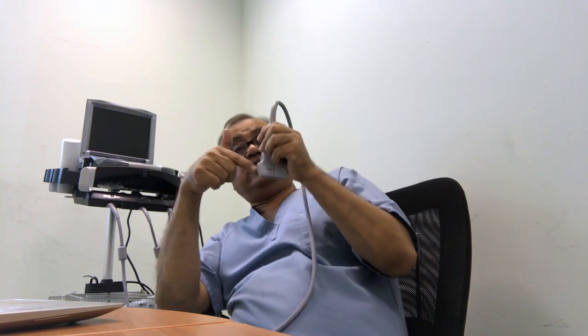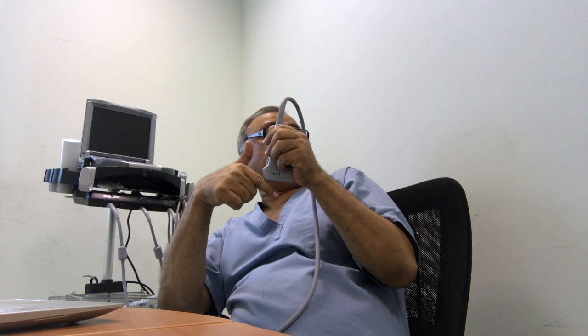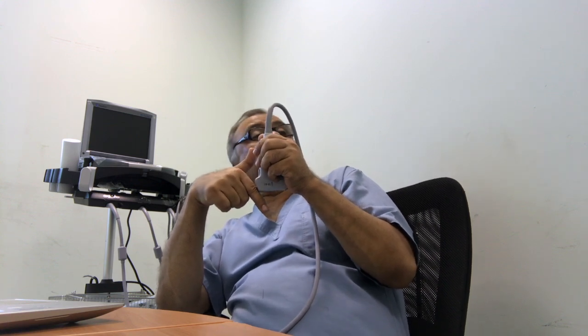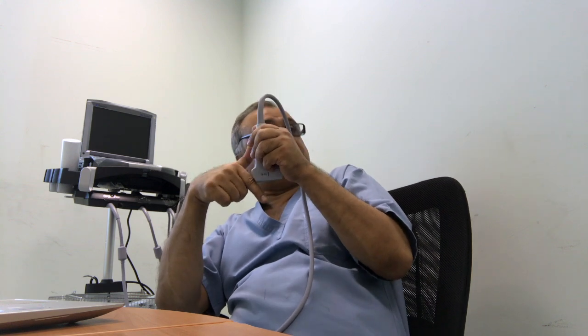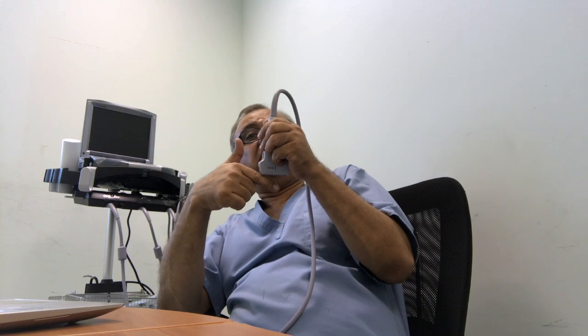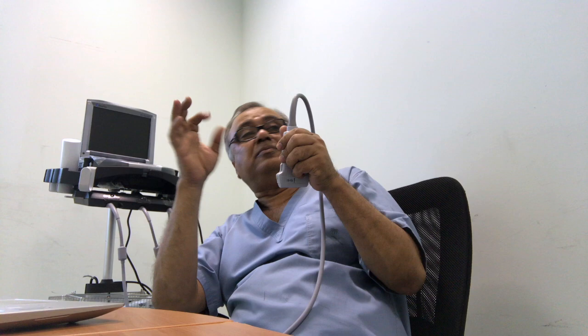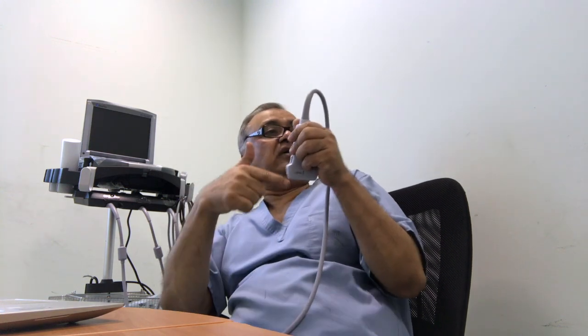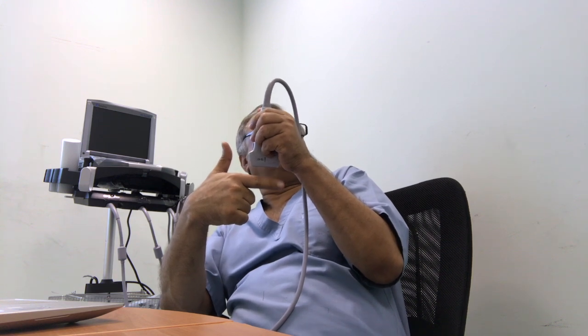And the second is the movement of your artery. If you go to the routine technique, you have to make a 30 degree angle. If you make more than 30, your needle will not be visible. If you make 30 or less than 30, you will see it. But if you are coming parallel to the probe, you will see the needle in 100% of cases. This technique will allow your needle to come 100% in your probe line.